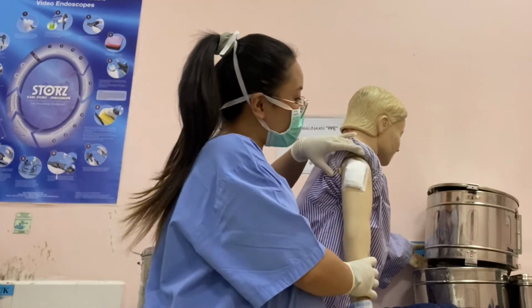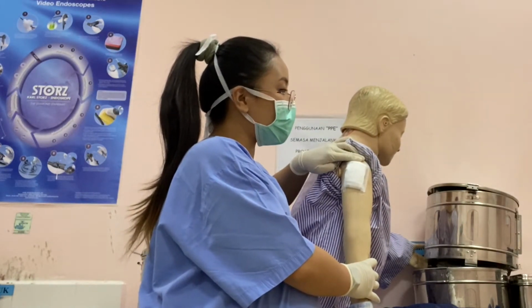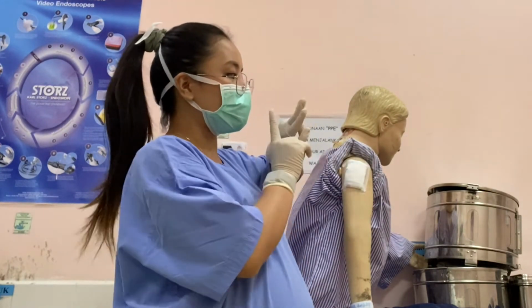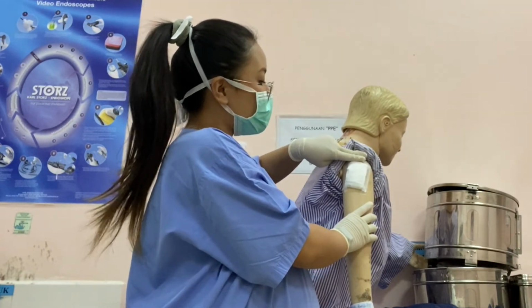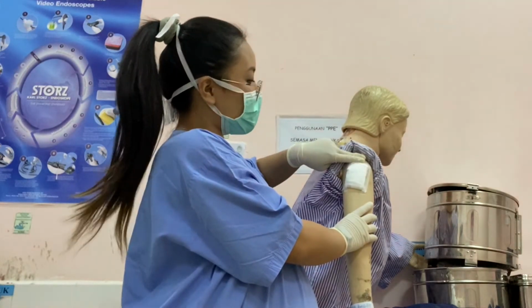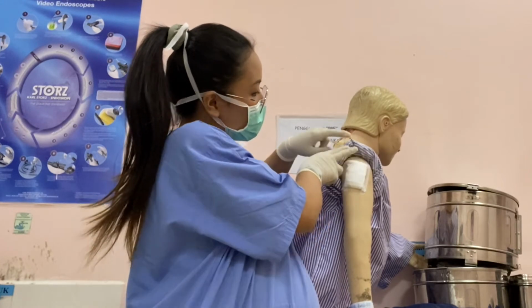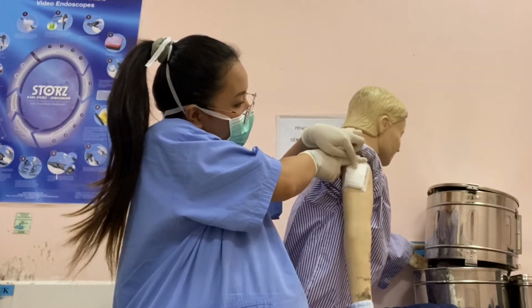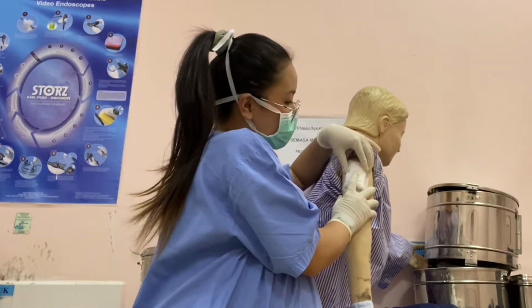Over here, the lateral aspect of the upper arm, 1 to 2 inches below the acromion process, or by placing the index finger and middle finger over the acromion process. So the injection site will be 1.5 to 2 inches below the middle finger. So over here, 1.5 to 2 inches. So the place of injection is over here, this side.